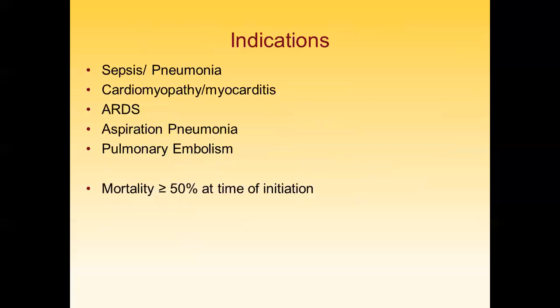Do you, when you give a blood transfusion, go through the ECMO circuit? So they can put a lot of things directly into the ECMO circuit, fluids and transfusions, but it doesn't necessarily provide you any benefit other than having those forms of access. Maybe a little faster. Yeah, I'm not really pushing it faster than you can put it through. That's a good question.